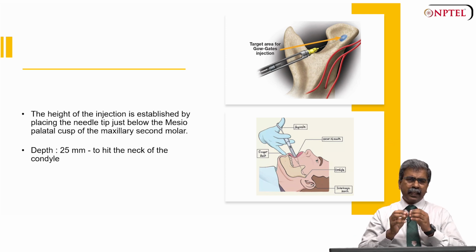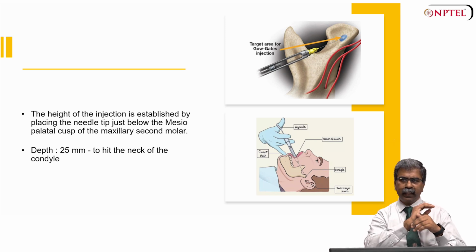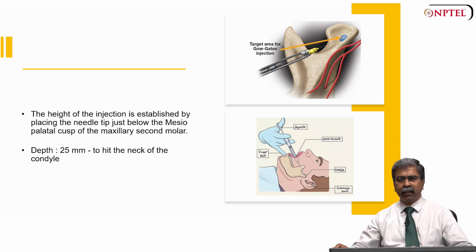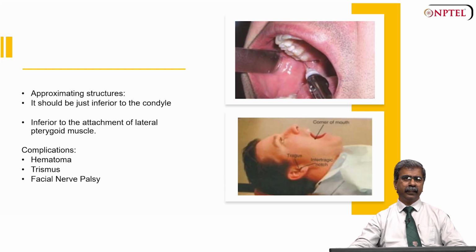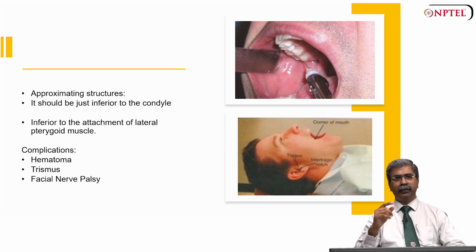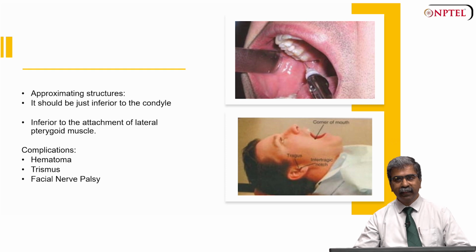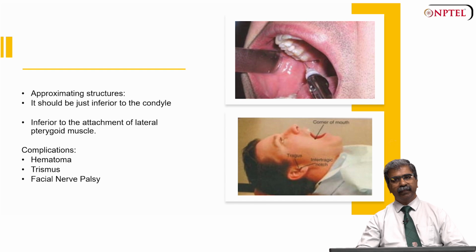And this technique, as mentioned earlier, targets the mandibular nerve effectively by using both the vertical and the depth positioning, increasing the success rate of the block for comprehensive mandibular anesthesia. What are the approximating structures? It should be just inferior to the condyle, inferior to the attachment of the lateral pterygoid muscle, and the injection site is located below the lateral pterygoid muscle where the nerve lies, ensuring proper anesthetic deposition.